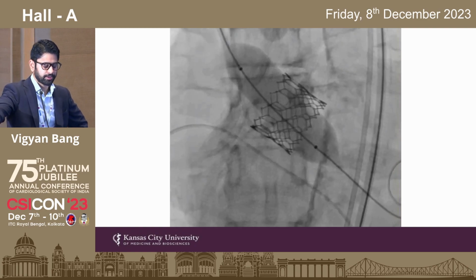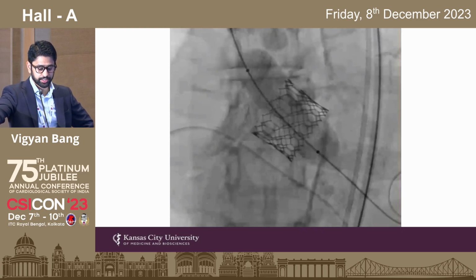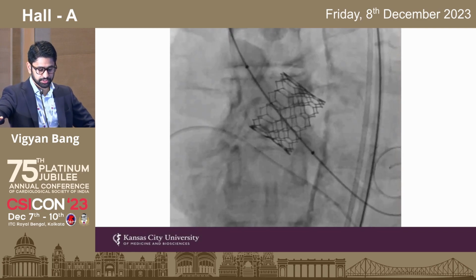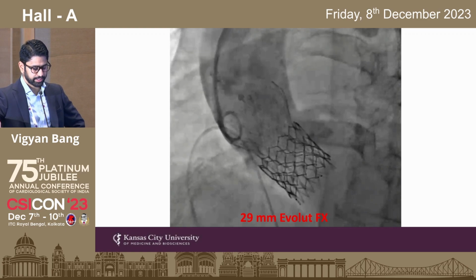So we chose a self-expanding platform. It was relatively difficult to cross this valve. In fact, after crossing, we tried to take the Medtronic valve platform bareback, and it just wouldn't navigate the valve. So this is a gentle predilation with an 18 millimeter TRUE Dilatation balloon. And after that, it was a fairly uncomplicated case.